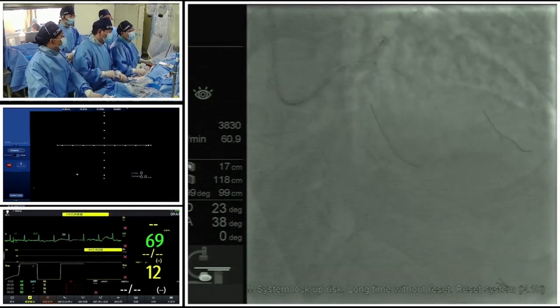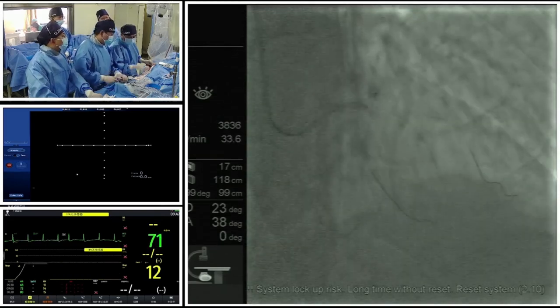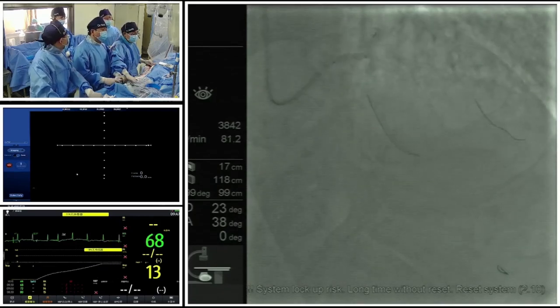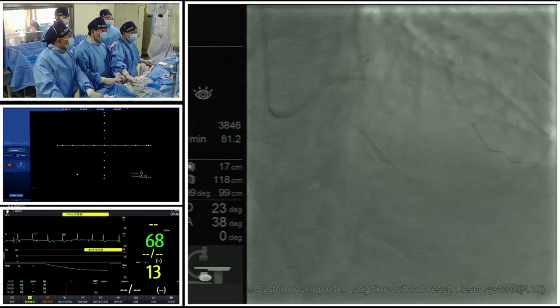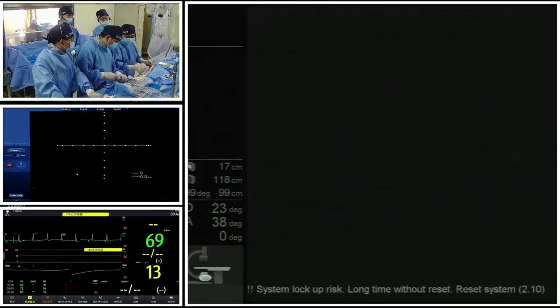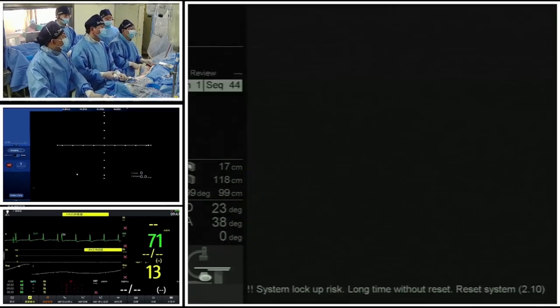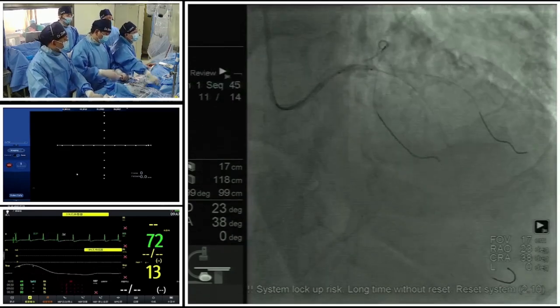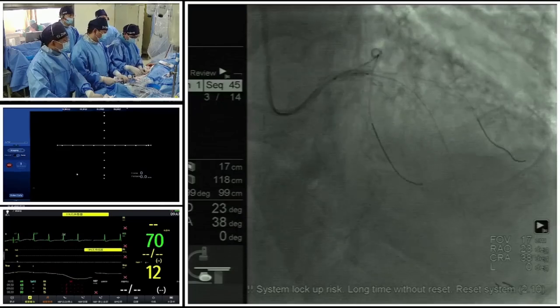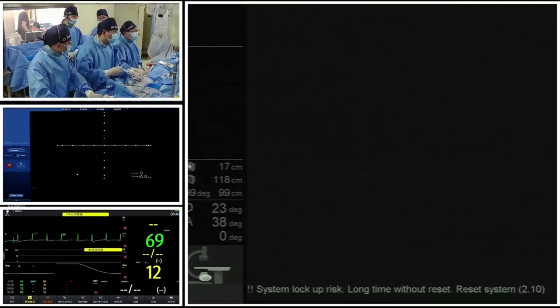So right now we give like 4 times of the shock wave. Do we check the imaging test, or do you want to give more shock wave? Or one more time? You know, to me, the shock wave is kind of new. Before, I thought when we use the shock wave, we should hear some sound like ta ta ta ta ta. But actually, there's no sound, right? It's kind of silent.